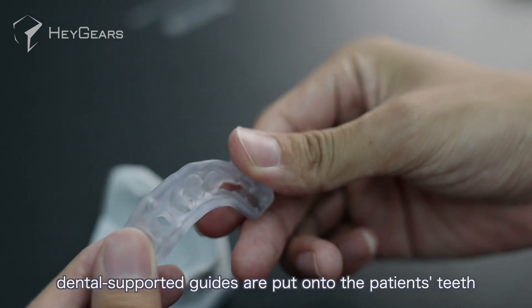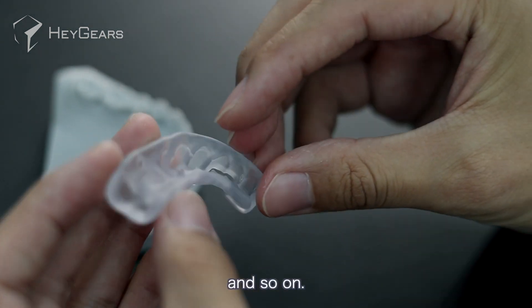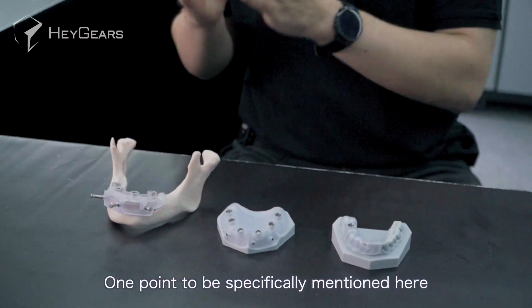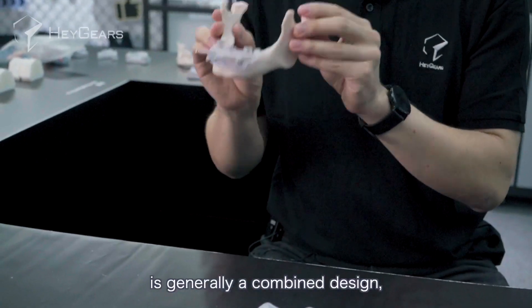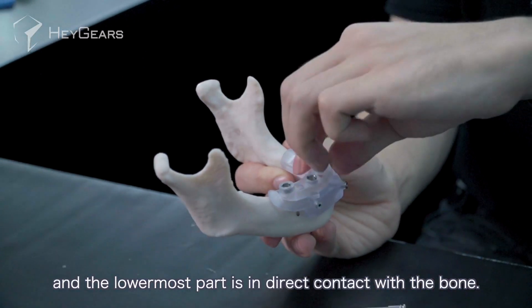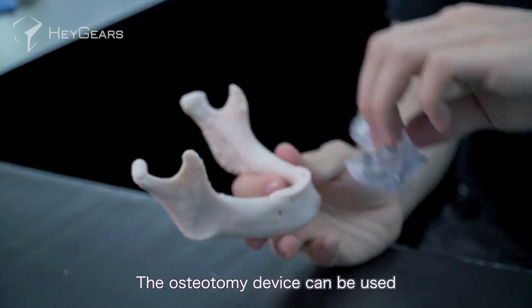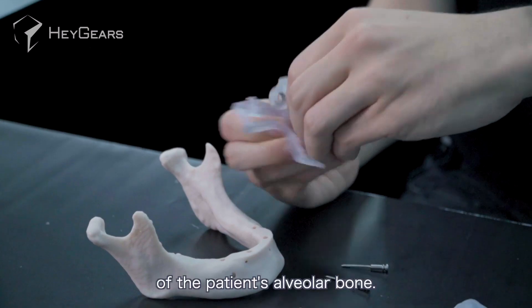As the name suggests, dental-supported guides are put onto the patient's teeth. One point to be specifically mentioned here is that the bone-supported guide is generally a combined design, and the lowermost part is in direct contact with the bone. The osteotomy device can be used to remove a large portion of the sharp parts of a patient's alveolar bone.